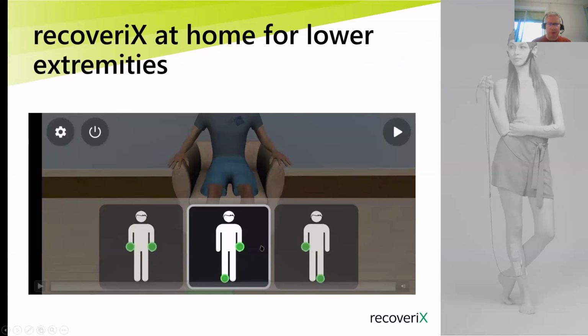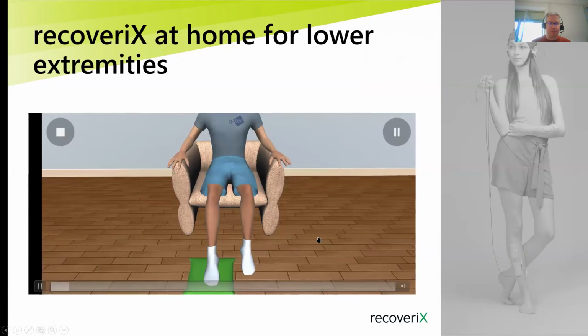And the same as I said for the lower extremities. So assuming you had selected to train the left leg, then, oh, now we have sound again. This magenta colored ball is helping the patients in the visualization, trying to lift the hand or the leg as much as to touch that ball.